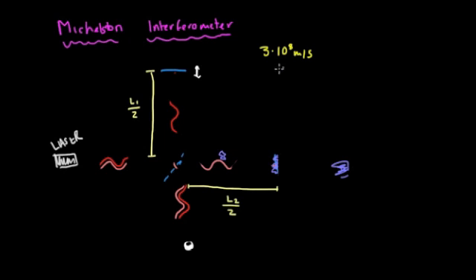That is more than 7 times around the world. So that's not really giving us any information about where this structure, this tissue, is localized. And so to get an adequate pulse, to get good resolution of where this structure is, we need a pulse that is about 10 to the minus 15 seconds. That is a femtosecond pulse.